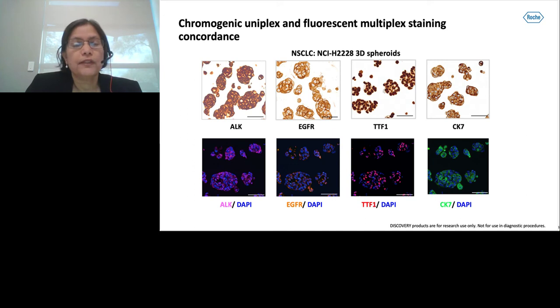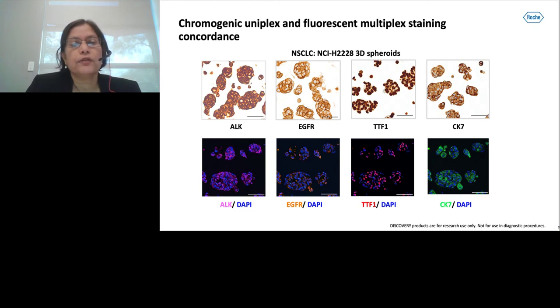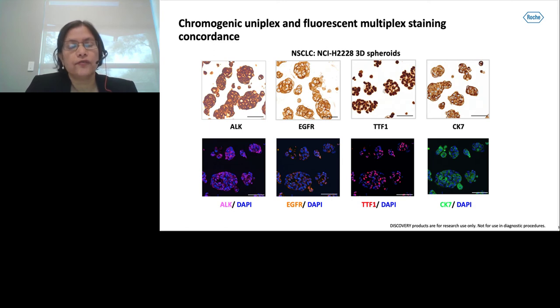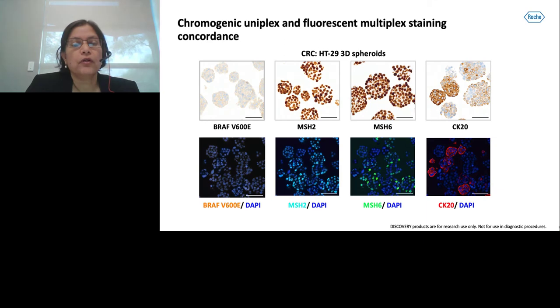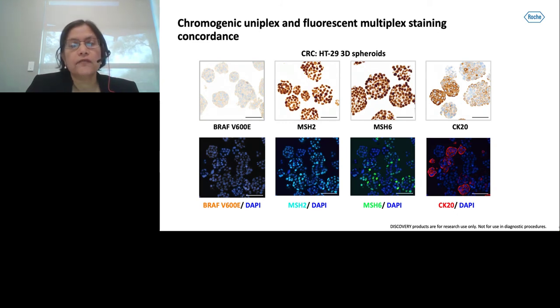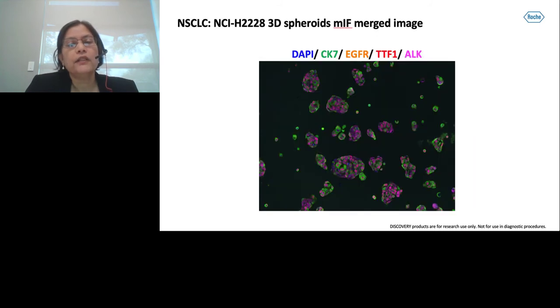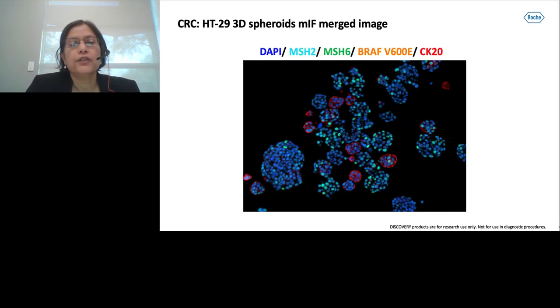Once we completed the fluorescent multiplexing, each biomarker was tested with chromogenic multiplex slides for concordance study. You can see the chromogenic uniplex and fluorescent multiplex staining concordance of ALK, EGFR, TTF1, and CK7 in H2228 3D spheroids. Similarly, we checked concordance for BRAF V600E, MSH2 nuclear staining, MSH6 nuclear staining, and CK20 in HT29 3D spheroids. Finally, here is a merged image of H2228 3D spheroid with four biomarkers and DAPI, and an HT29 3D spheroid multiplex merged image consisting of MSH2, MSH6, CK20, and BRAF V600E.